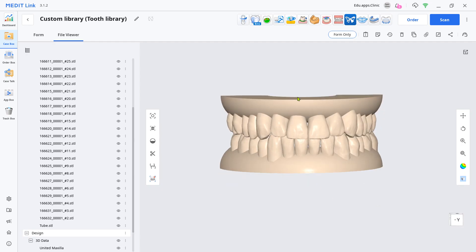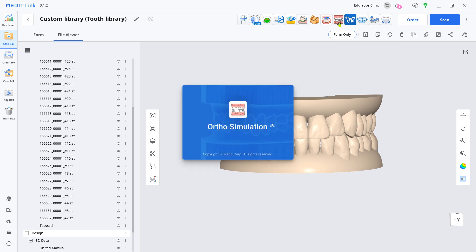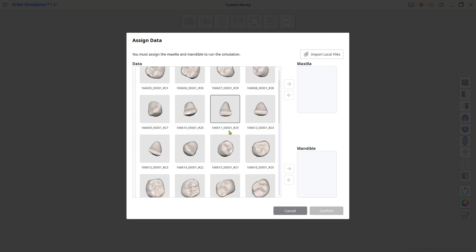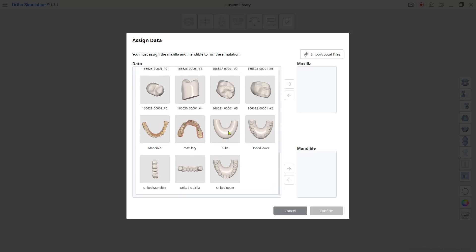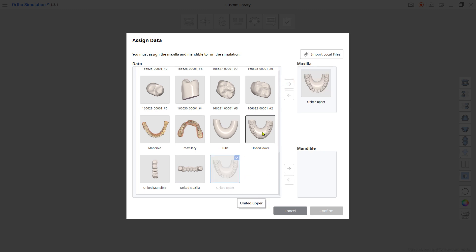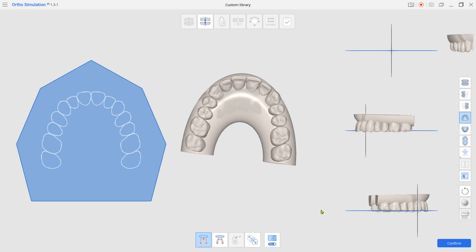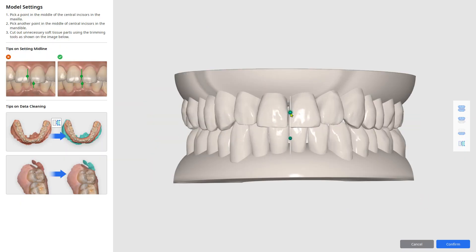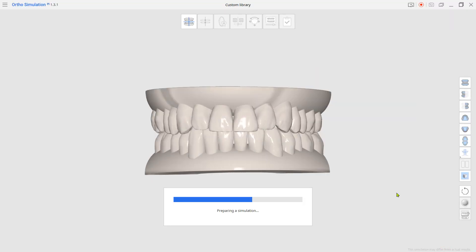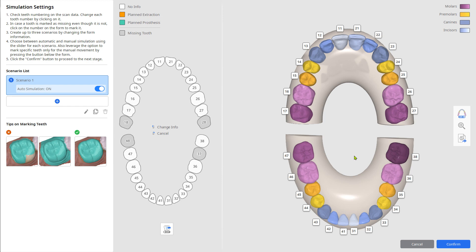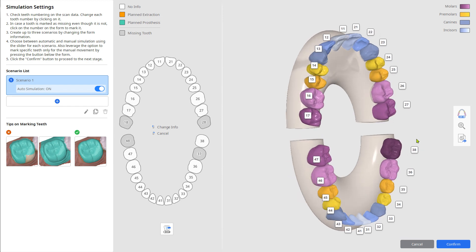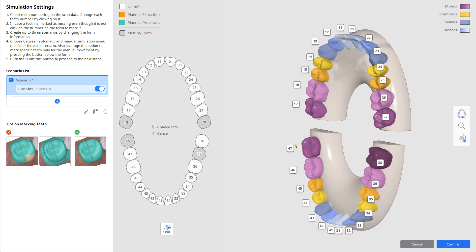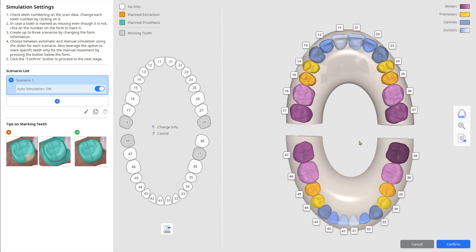Load the files into the ortho simulation app. Set up the teeth along the process. In simulation settings mode, correct the tooth number if needed. Deactivate auto simulation from the left.